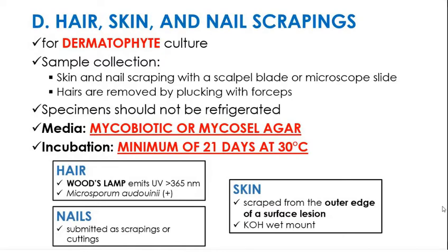So, we have different methods here that are placed na rin kung sa Wood's lamp kasi pwede mo munang i-check kung mag-fluoresce yung hair para yun ang ipipick mo o yun ang ipa-pluck mo.